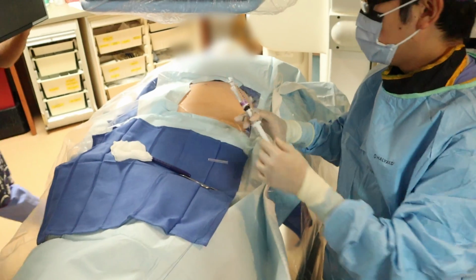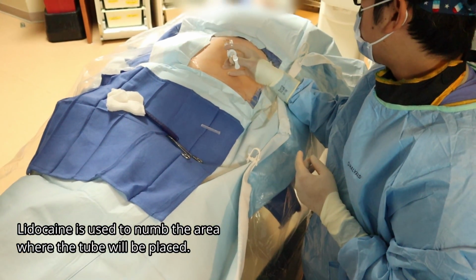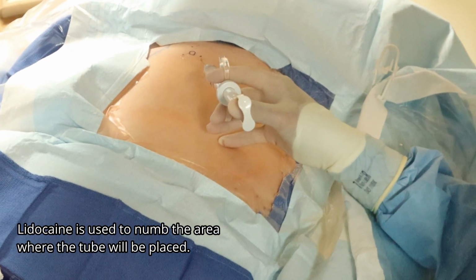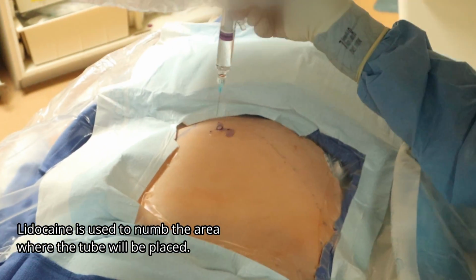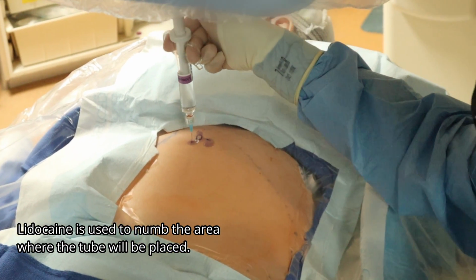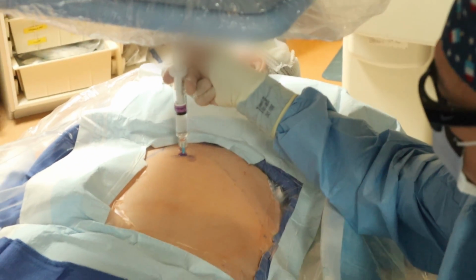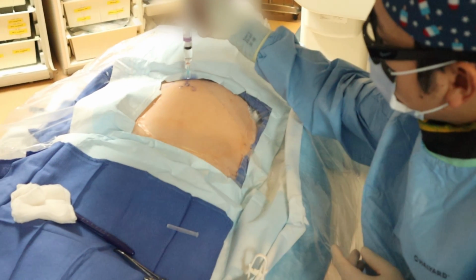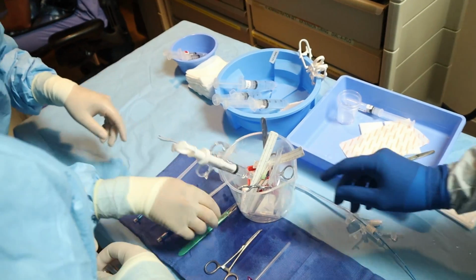We're going to do a little bit of lidocaine. Okay, we're injecting lido without epi. We're going to give a nice skin wheal at the access site. Under deep sedation, so it shouldn't be too bad. That's enough. I'm going to go a little bit deeper with the lido. Always aspirate the needle back before you inject the lido, to make sure that you're not in a vessel. Okay, now we're done with the local. Alright, start coming back. We're going to do a tiny skin nick.